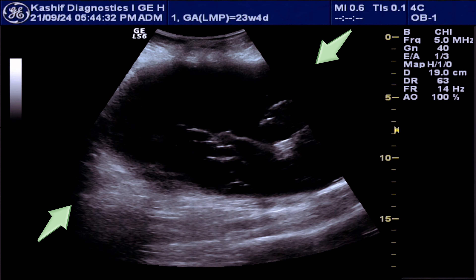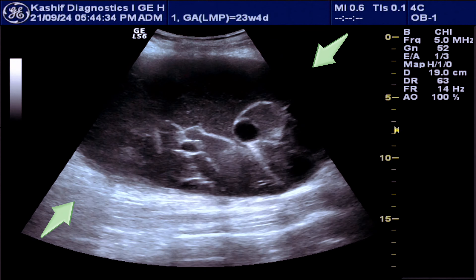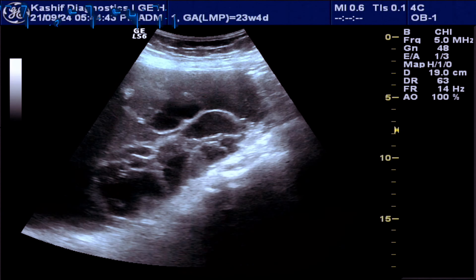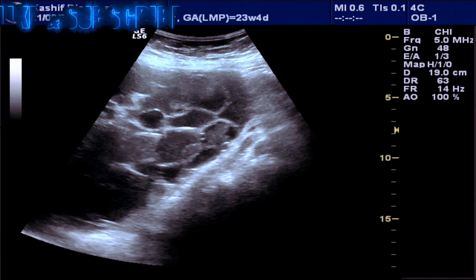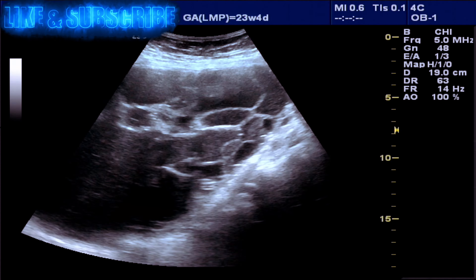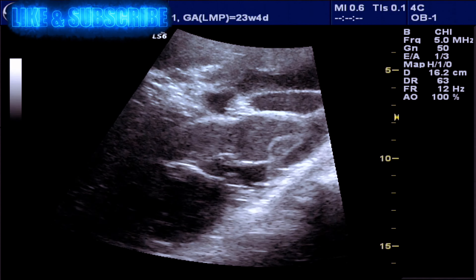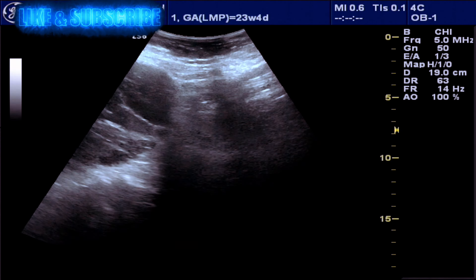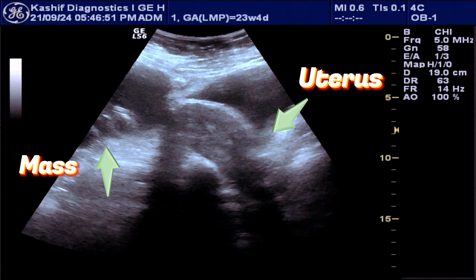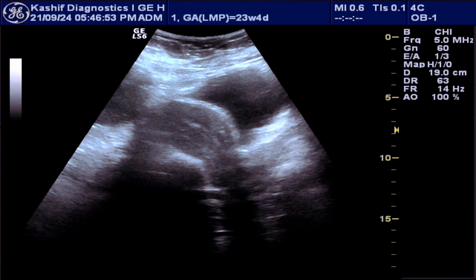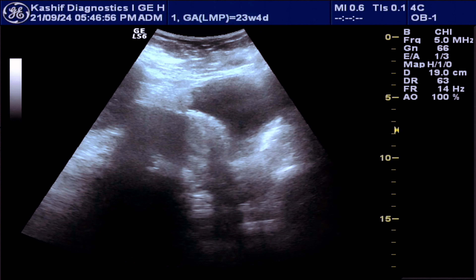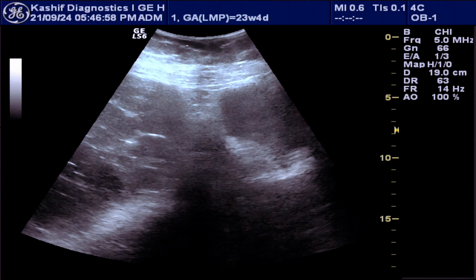When the abdominal ultrasound started, we see a large cystic mass in the abdomen. The origin of this mass is the pelvis, starting from just adjacent to the uterus, in the left adnexa extending upward up to the upper third of the abdomen, along the midline and on the left side.